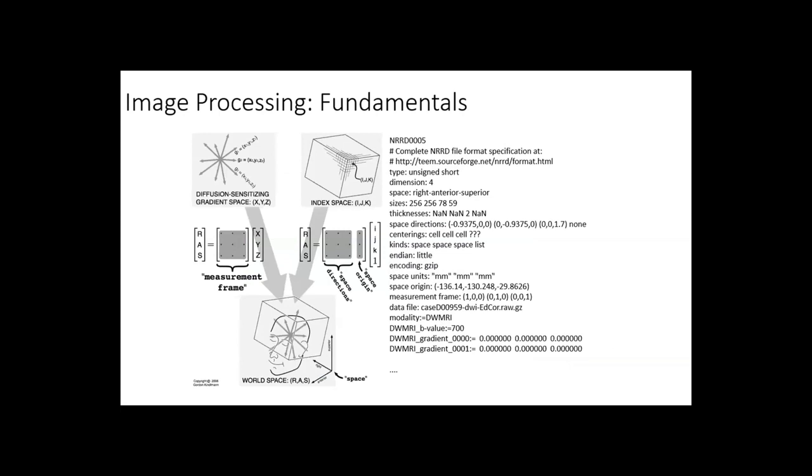So we talk about how to find a right coordinate system to index the pixels. And there are a lot of other questions, like what is the data type? Is this 8-bit per pixel, or are you using 16-bit to represent the pixel? If you are using 8-bit, then the intensity range is from 0 to 255.